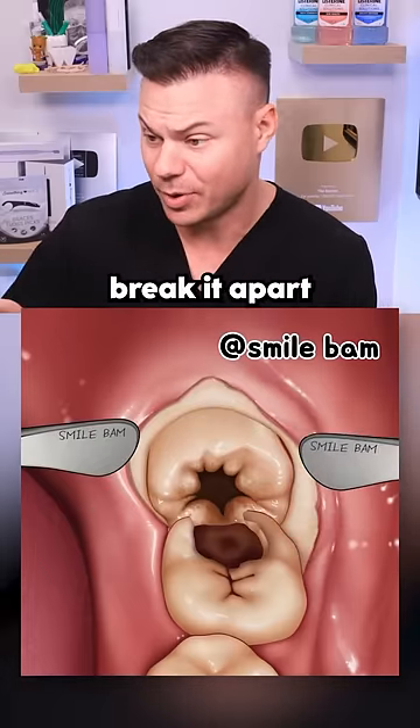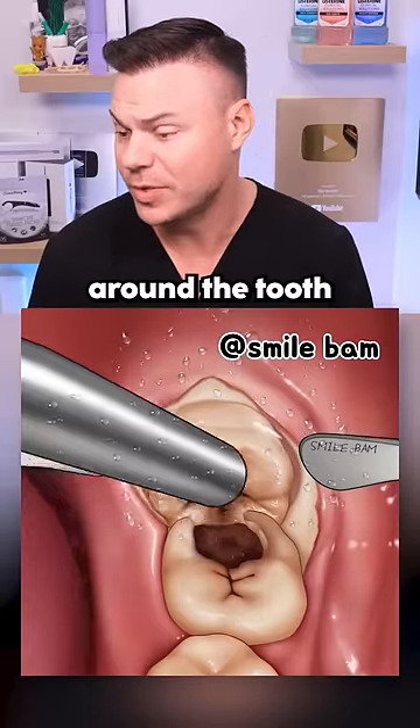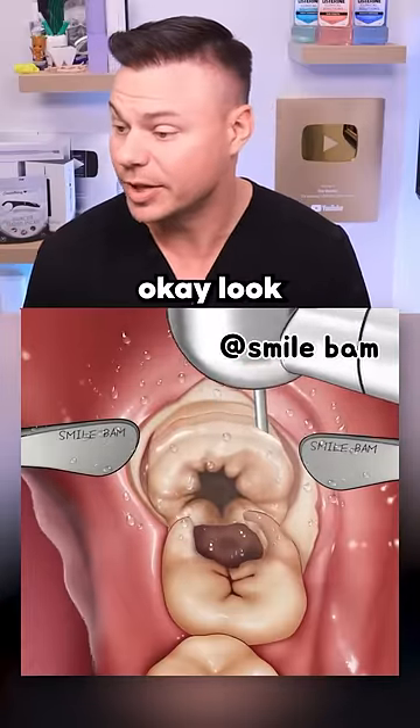Next up, normally you drill the tooth in half and break it apart. It looks like they're getting rid of the bone around the tooth that could be locking it in, kind of revealing more area for them to get the forceps on, which is what they use to pull it.